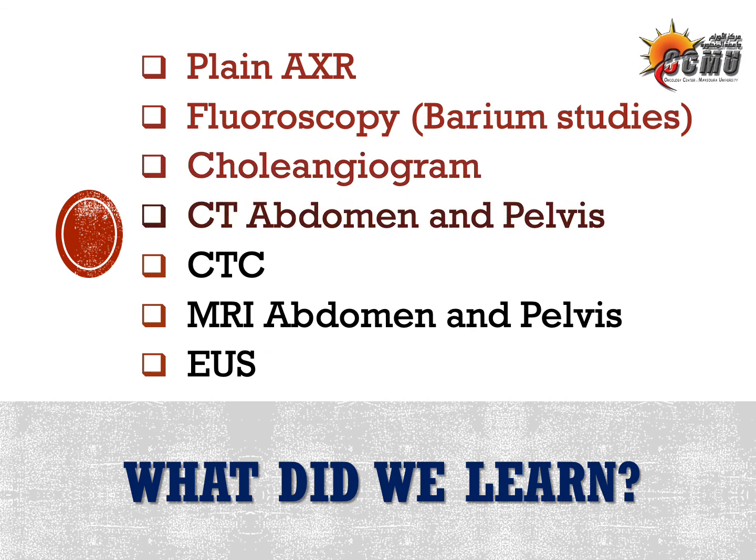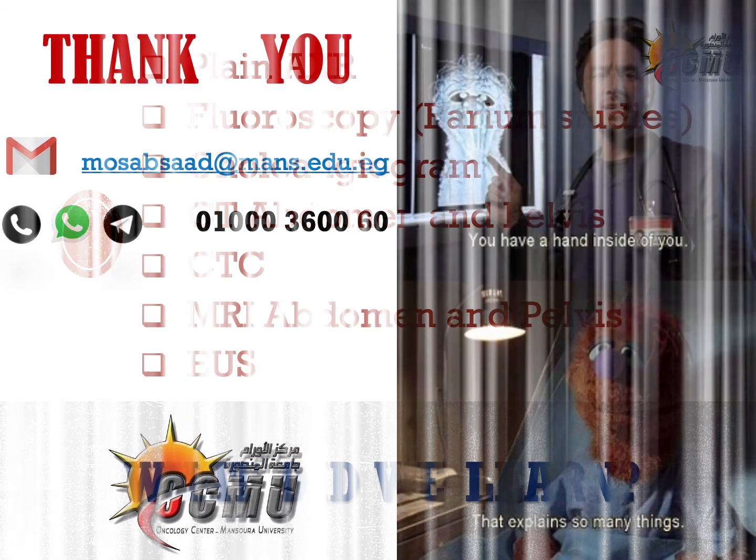So we've had an overview of an X-ray without dye or plain X-ray of the abdomen, and we have an idea about the CTC, MRI, and EUS. The remainder of the topics will be discussed in the next lecture, inshallah.